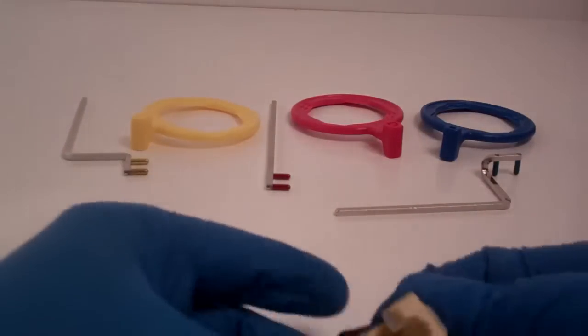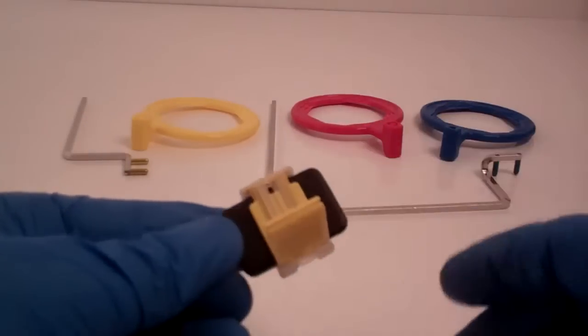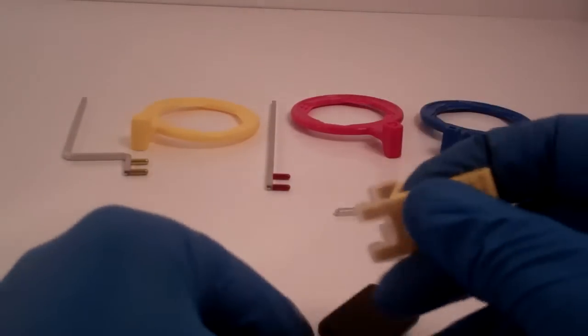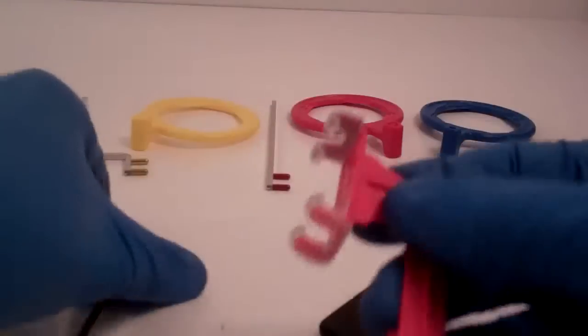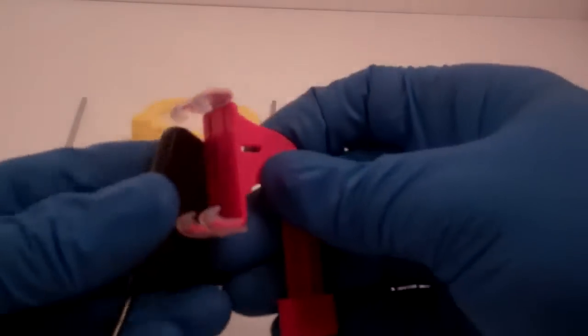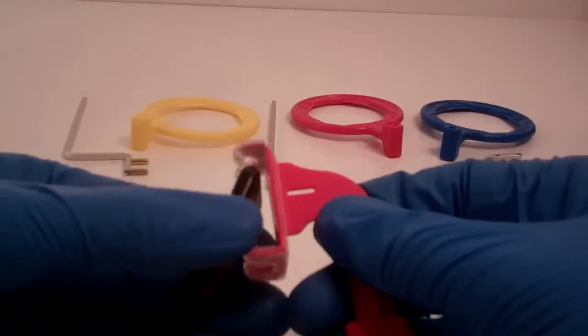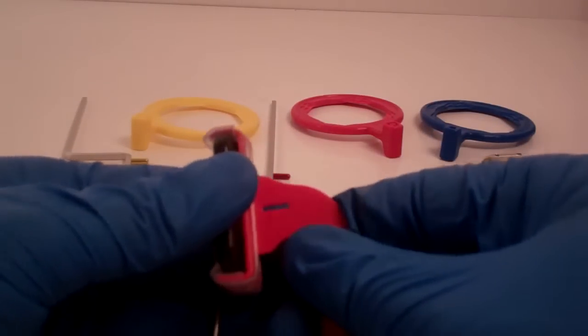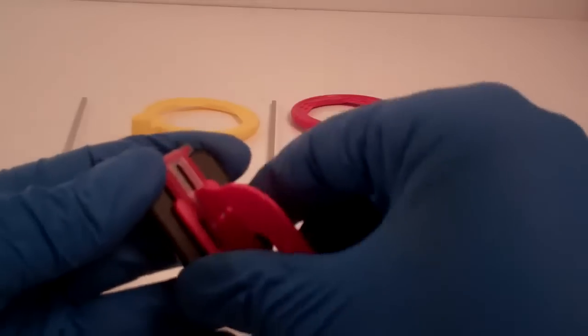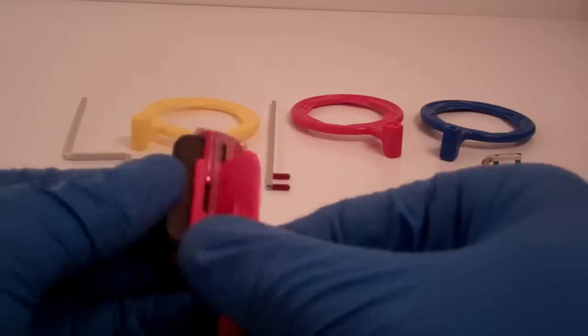And the same holder works with a size 1 or a size 2. There it is in the size 1. There is a horizontal bite wing piece. And again, it's very fast loading. You just use the edge of the sensor to lightly press up and center it in the bite block and you're ready for an image.